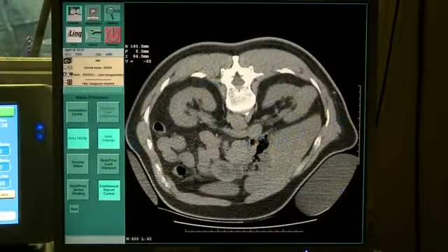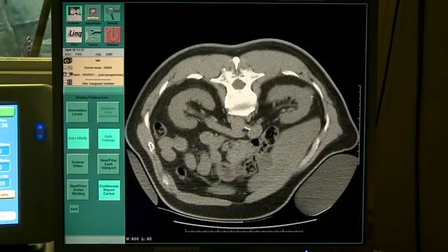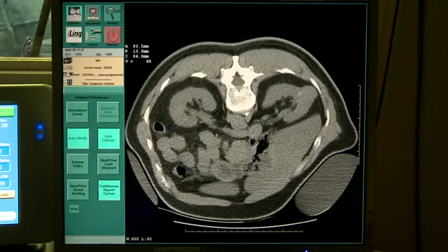So let's get started. These are initial non-contrast images, just localizing images, low dose. And here we can see the target tumor. From this set of images, we'll pick our table levels going above and below, give contrast, and help define the inner margins of this, which will be key in terms of defining its size and ablating it correctly.